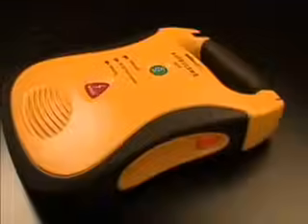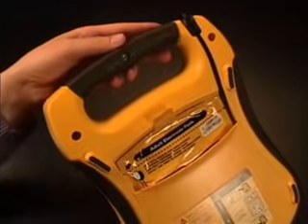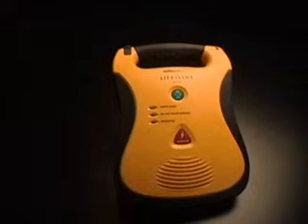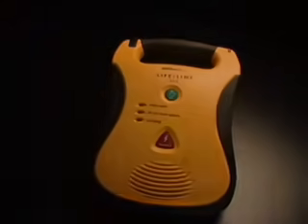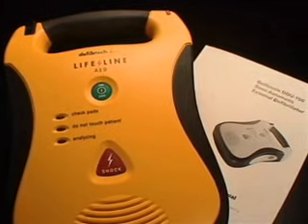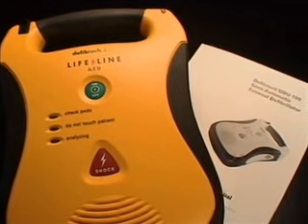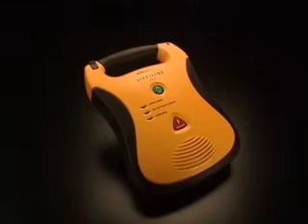The Lifeline AED should be kept with the battery pack inserted and the pads connected and stored in the pad holder. The unit should be kept in a readily accessible location with the active status indicator visible. This video presents only a quick overview of the Lifeline AED — refer to the user's manual for more detailed information. You should also get comprehensive AED training before attempting to use the Lifeline AED. With sophisticated medical technology this simple to use, now anyone can save a life.